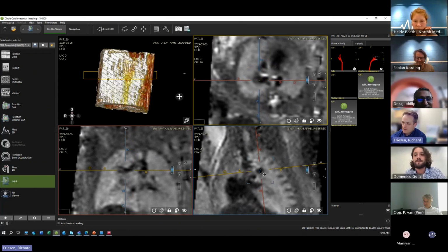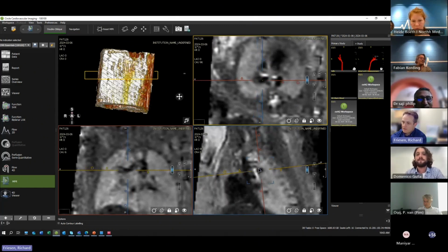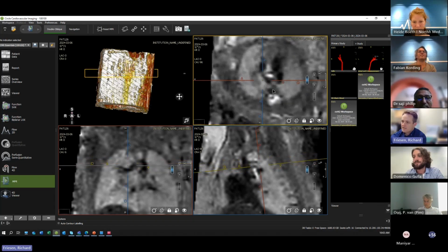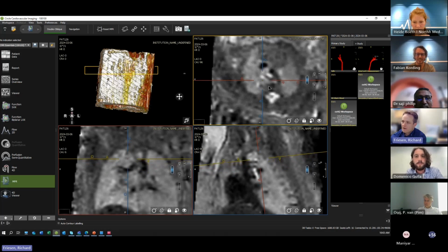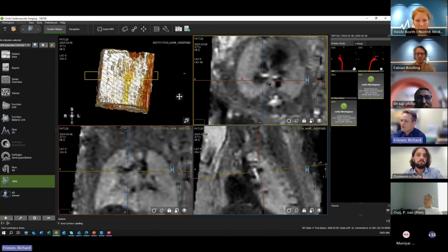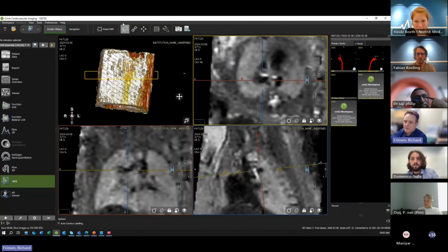So coming back here laterally, and then on the sagittal view, we see two separate insertions into the SVC here. So this delineation of that venous anatomy was a little bit more clear on this view, and consistent with what we saw. Furthermore, we see these dilated left-sided pulmonary veins as well.